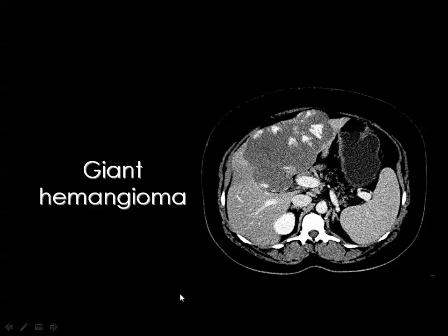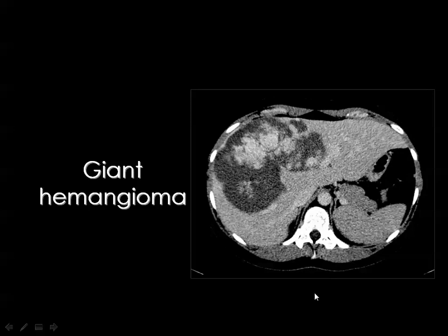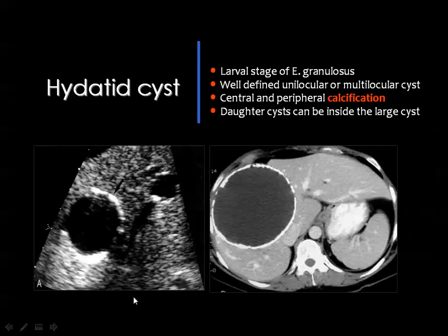And this giant hemangioma will not fill totally with contrast media because of the presence of thrombosis in its central part. This is also an example of a giant hemangioma occupying part of the left lobe of the liver as well as the right lobe.